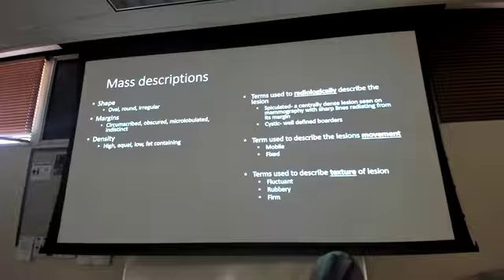Yeah. What about breast augmentation? Is it going to show up super white or? Yeah, it will not. The implant will, right? We had that question on the break too. You still get mammograms, but it will separate. Some of them, it depends on the type of mammogram it is, but they have special settings that they can do to make sure it doesn't affect the image. Does it hide the cancer easier? It does not, because of the settings that they can order.